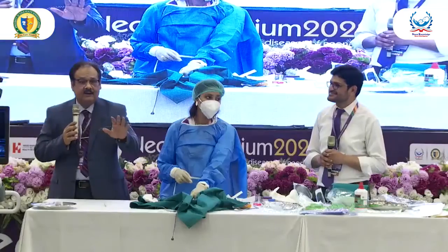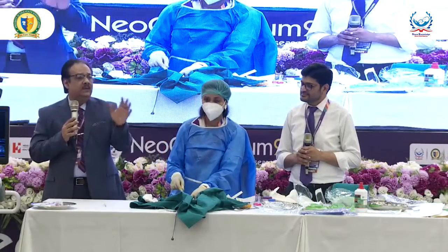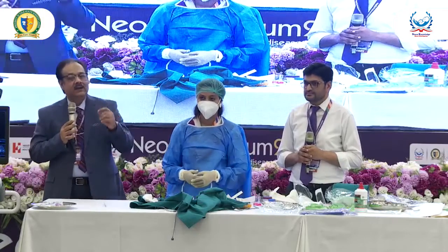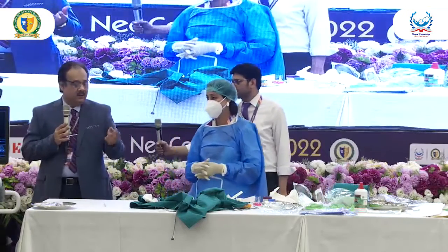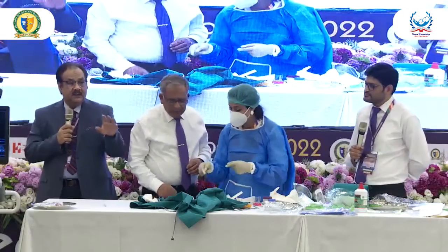Just leave it. Subclavian is a big vein. Okay. Just leave it. Don't try to put another line on this thing. It is a long line. Okay. You can say that this cannot be the central one, but it is the long line. So after this, yes, sir. Yeah. So this is the thing.